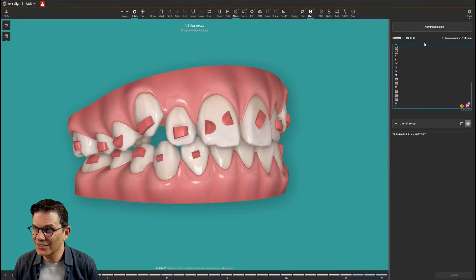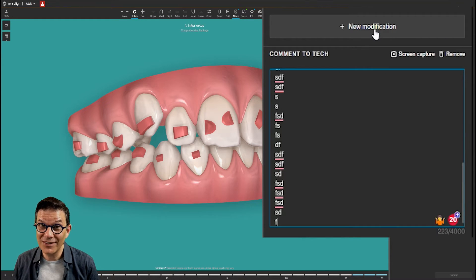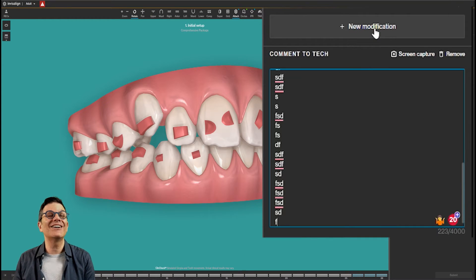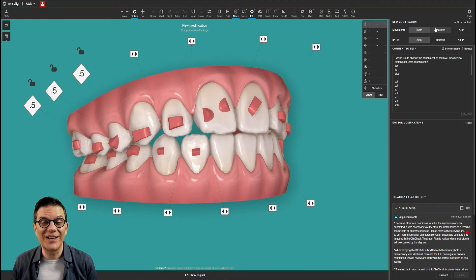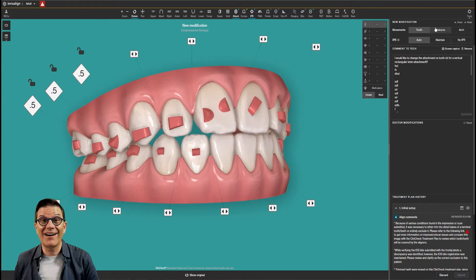So what if you could do it yourself? Yes, it's possible. This is what the ClinCheck Pro is. What is the ClinCheck Pro? Well, just look at the top here where it says 'New Modification.' When you click on this, you enter another world. You enter the 3D world, and this is where you can modify everything yourself.